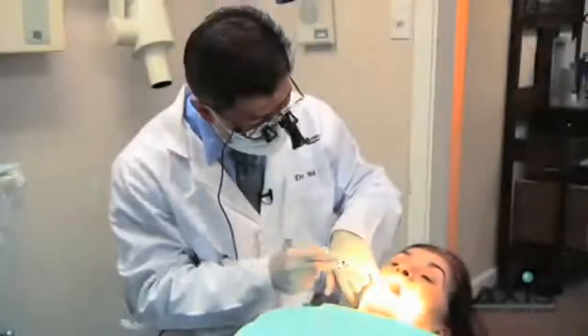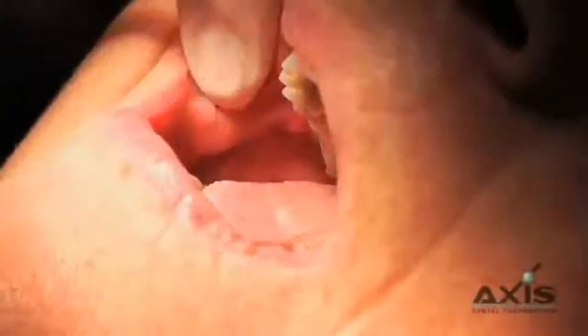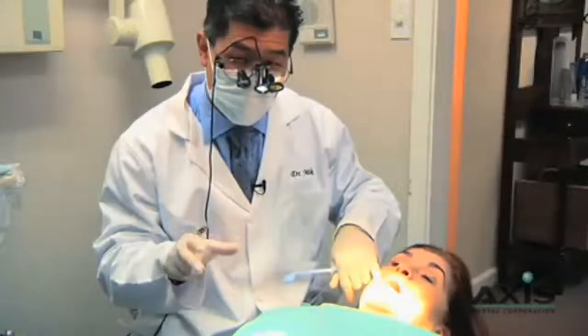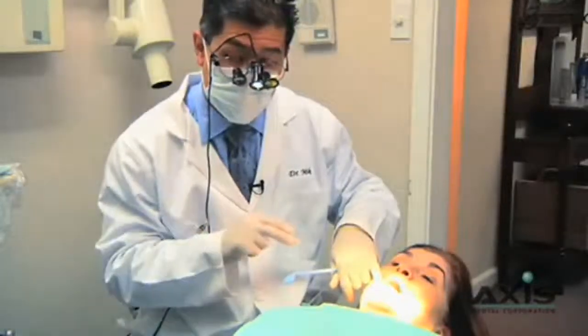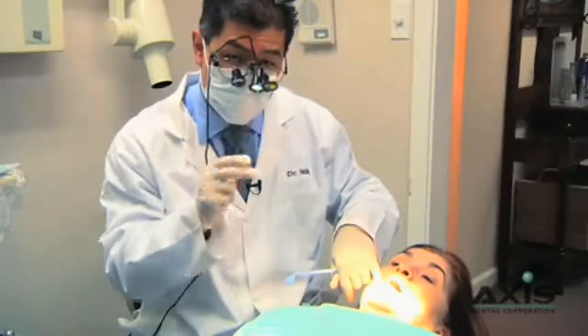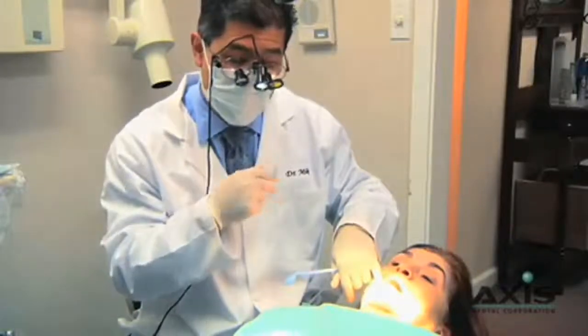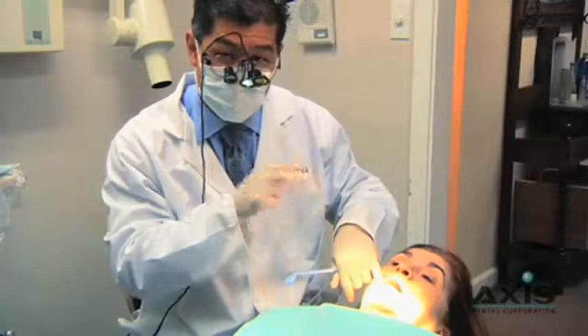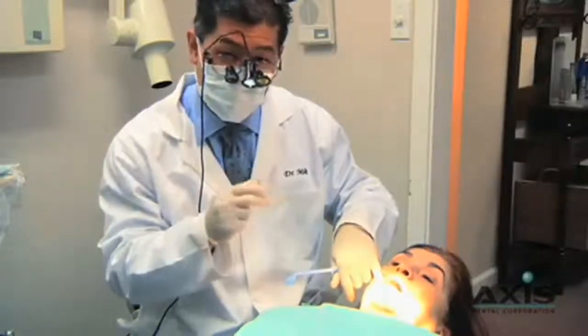We're going to start doing some occlusal adjustments on tooth number three. One of the things I try to be aware of is that Jan is currently in a reclined position, so her jaw position may be slightly retreated because of gravity. We'll do our initial adjustments in this position and then seat Jan upright and just double-check the bite before we let her go.